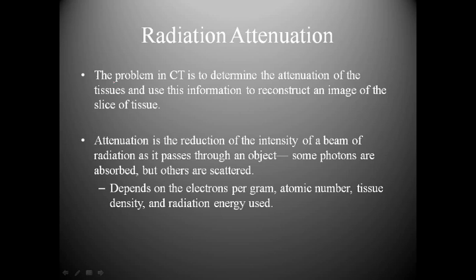So basically, one important thing that I'm sure we apply to conventional radiography, but many times it's disregarded, is that different tissues affect how the image looks. And I think that's something that we would all agree to. Bone will show up as white, and air will show up in conventional radiography as basically black or some form of gray.